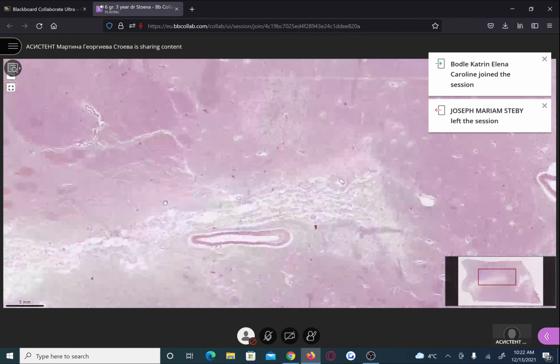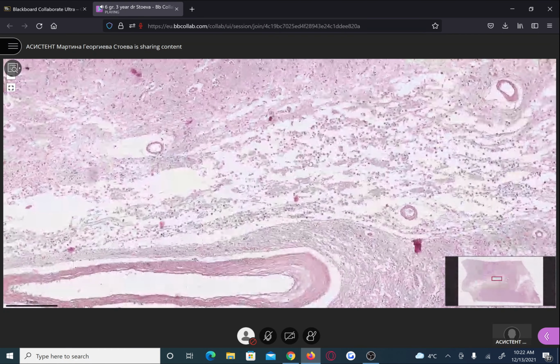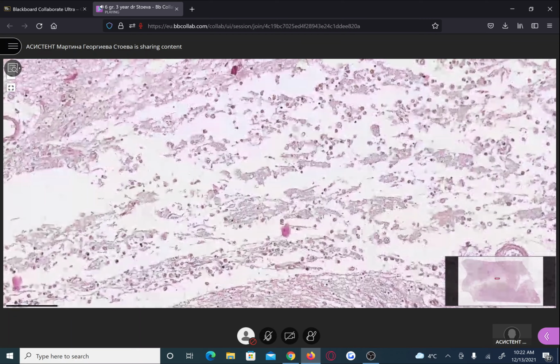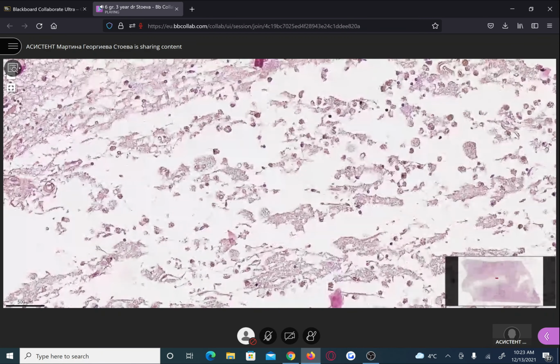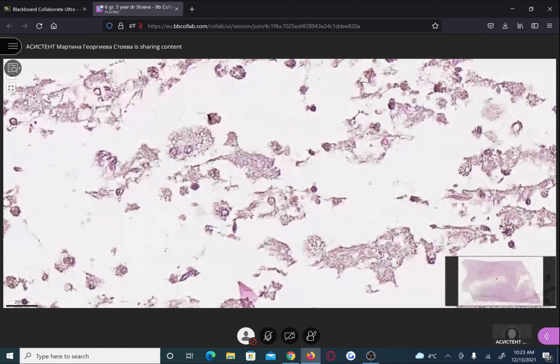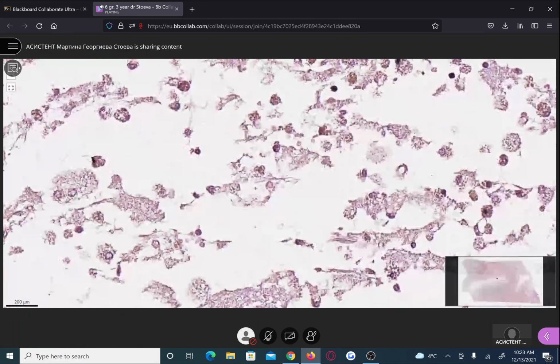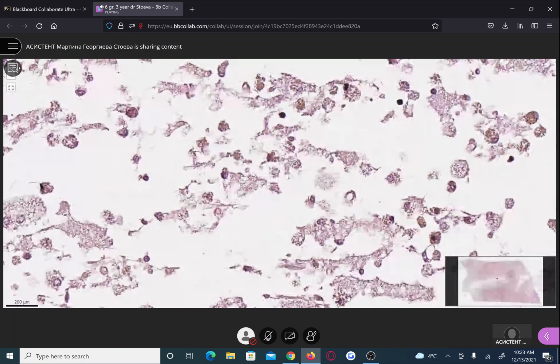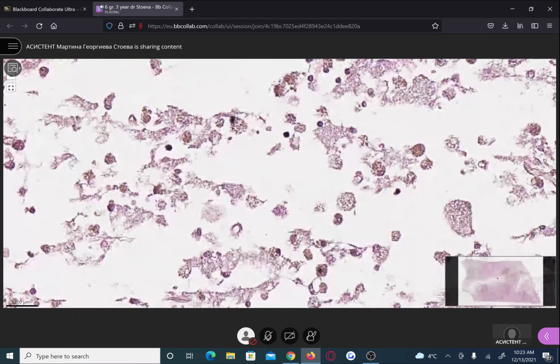And then we move to the necrotic area. I already mentioned that it looks like a cavity, and yes, when we zoom in, we can see that this empty space actually is a cavity that is filled with lipophages. Lipophages are macrophages filled with lipids, and they are the ones with bubbly, foamy cytoplasm. But at the same time, we can find also some macrophages that contain pigment.